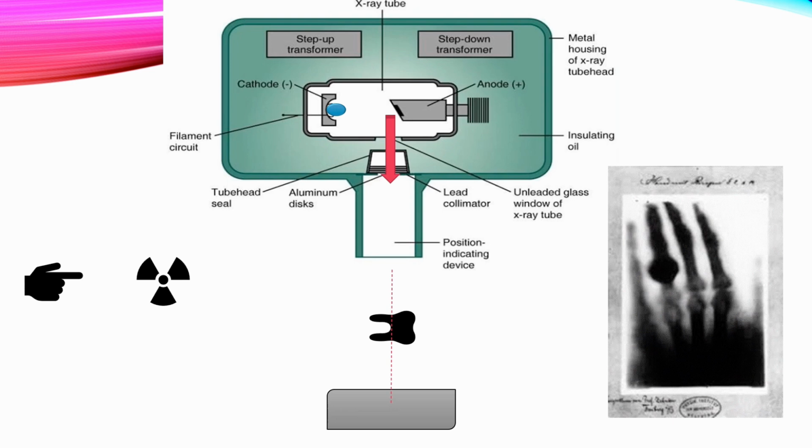Once you push it, then you send the 60,000 volts of energy through the tungsten filament of the cathode. It starts to emit the negatively charged electrons that are drawn to the positively charged anode and hit the tungsten target and displace electrons. It creates this chaos there, this ripple effect where one electron hits another electron and so forth.